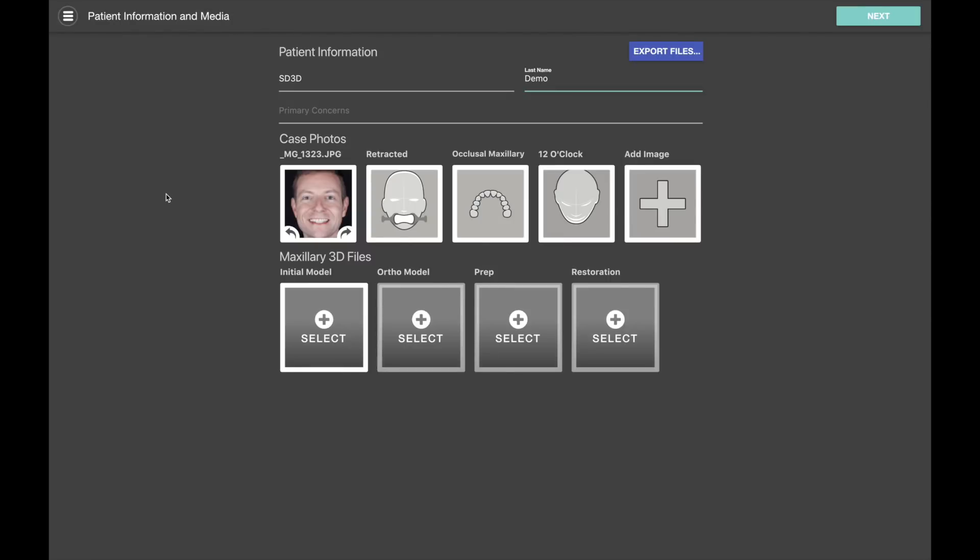Hello and welcome to Smile Designer Pro. In this video we'll be covering the new support for intraoral scan files that was introduced in version 3.1. If you haven't already watched our introductory tutorial, you should start there. This video covers a more advanced workflow incorporating intraoral scan files and other digital models into your 2D planning.